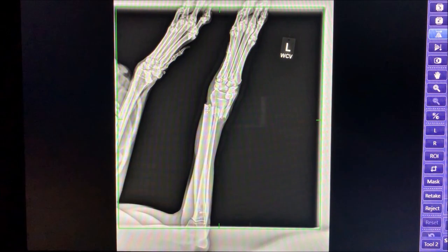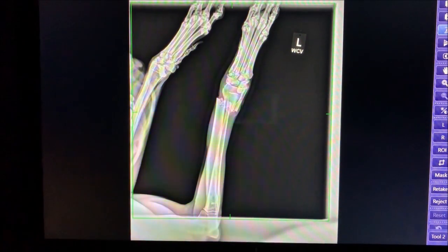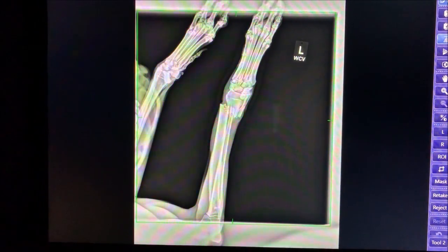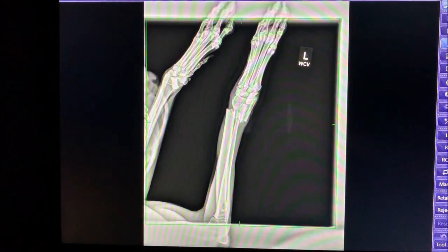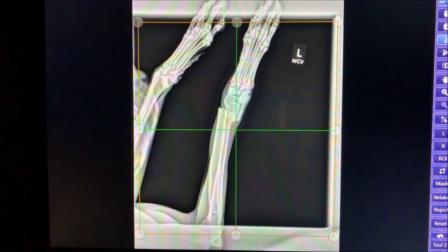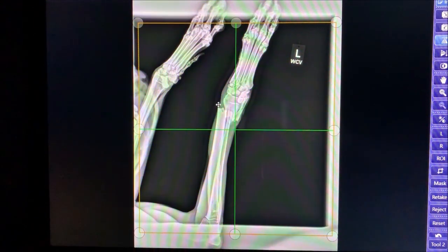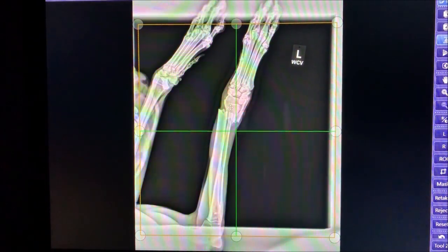The fracture is quite displaced, which means the bones aren't in line, and you can see there's a lot of soft tissue swelling. The bone is extremely close to coming out through the skin, which is a very big worry when it comes to infection. What we're going to have to do to fix this greyhound is realign the bones — distract the leg, pull the bones apart, and then stabilize it. This greyhound will need a bone plate going all the way up the leg with several screws. That's the plan for today — hopefully we can save this dog's leg and get him moving around again.